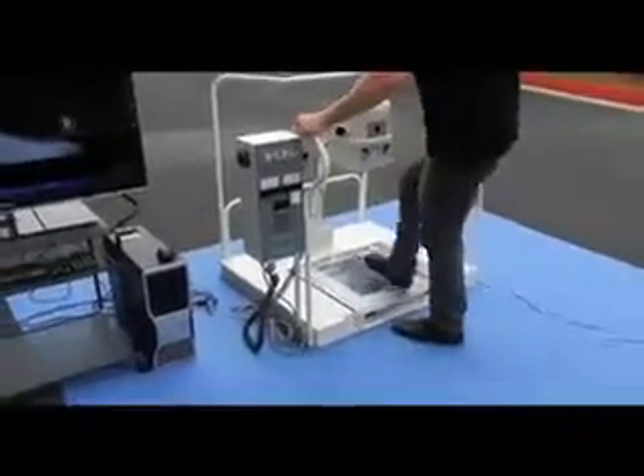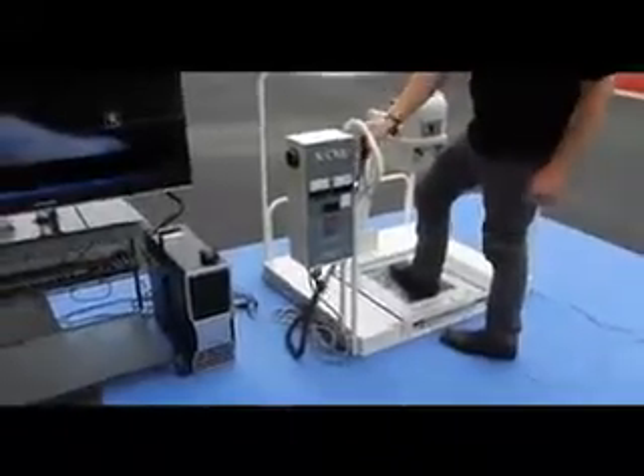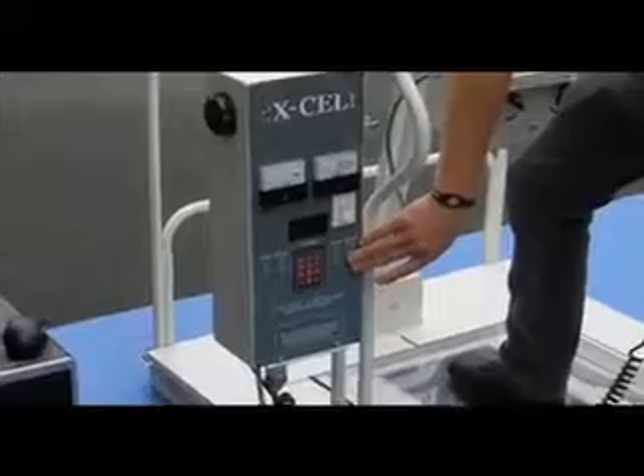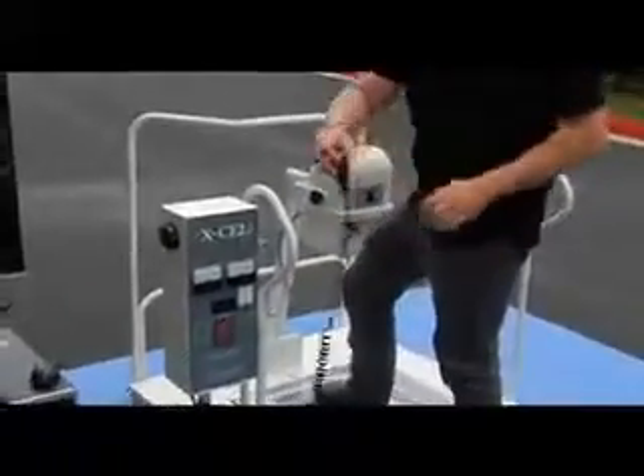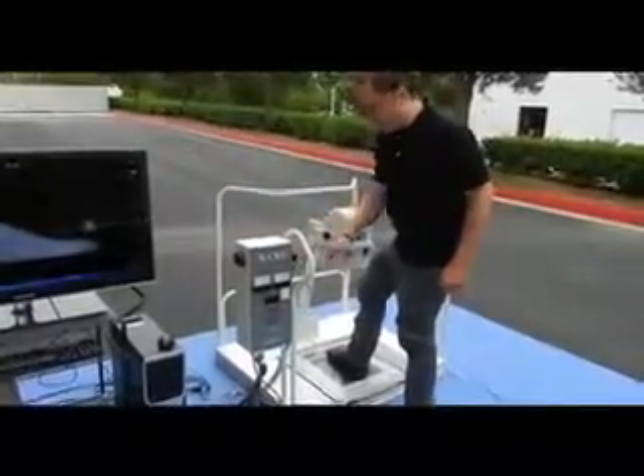The patient would put their foot up on here, and then the technician could take the exposure switch, set the right techniques, and then take the shot. The shot would then come up onto the acquisition laptop screen, where it could be modified before saving it to PAC.